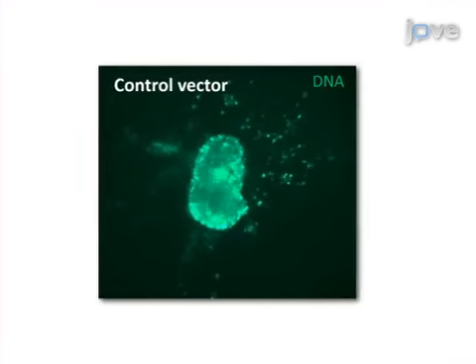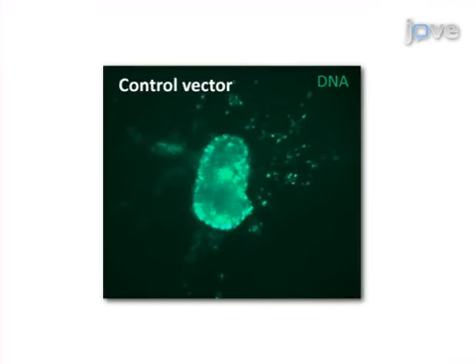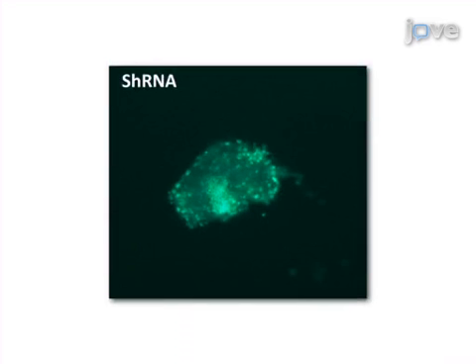Ultimately, the fate of injected, labeled, or genetically modified cells is monitored by confocal microscopy or light and epifluorescence microscopy, revealing the functional importance of specific genes and cells during cardiac development.